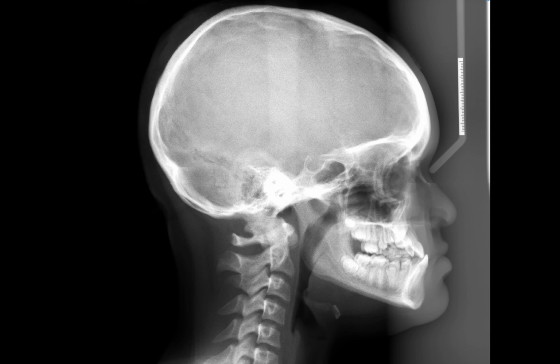This is Dr. Kim. So for today's video, I want to talk about why it's near impossible to position the patient such that you have a perfect alignment of the right and left structures. If you're orthodontic residents or orthodontists or a technician that takes lateral ceph on a regular basis, you would have noticed that there's always a little bit of discrepancy in the border of the anatomic structure.